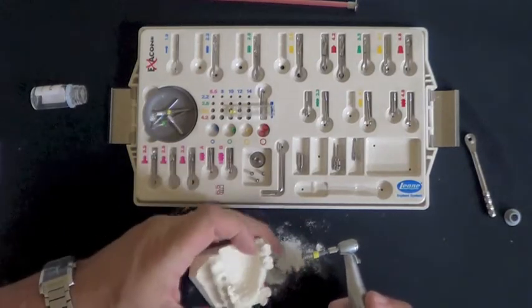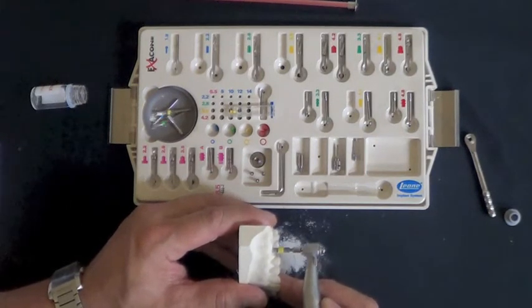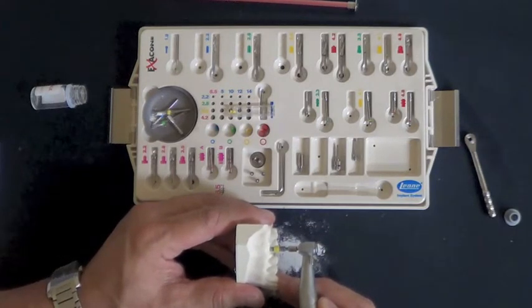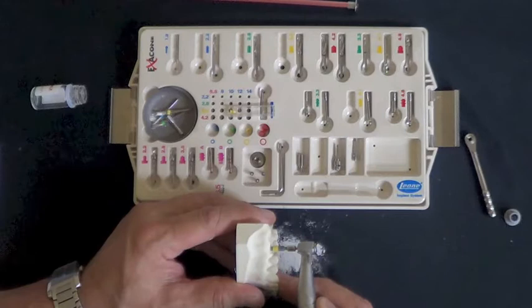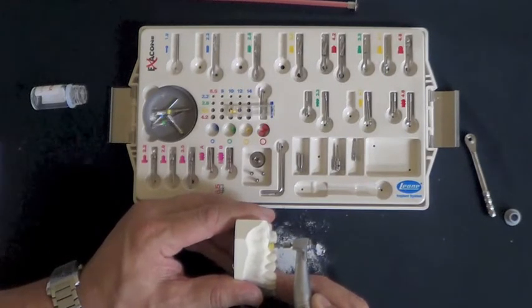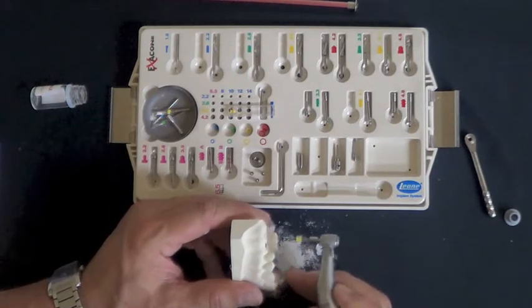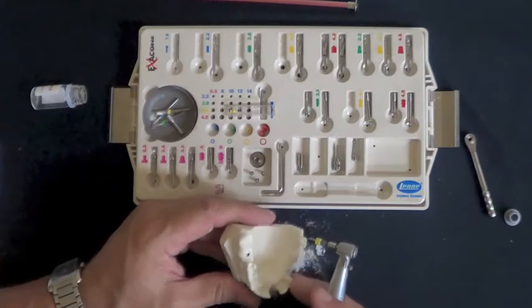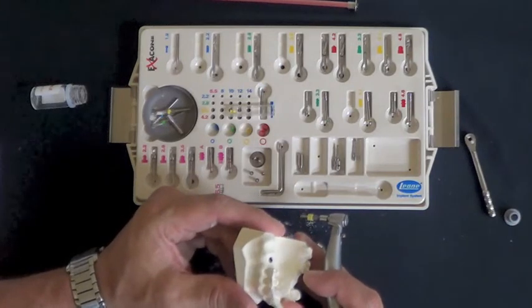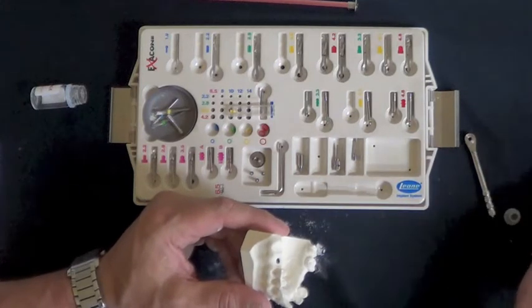So again in the model, let me position it here so that you can see it a little bit better. The implant gets positioned into the implant site, hit the foot pedal, and watch this implant rotate into the osteotomy. And as that yellow ringlet hits the site, it'll move up to where it's at crest. And you can see that it torqued out. And then again look at the implant and it is placed at the crest of ridge. And that is now an implant that's seated.